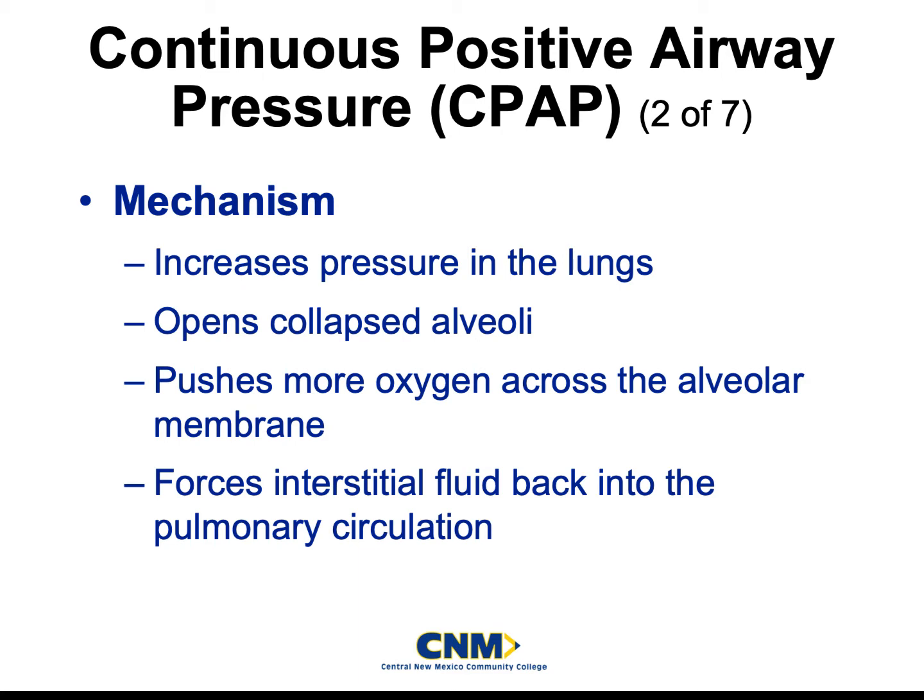This machine has something called PEEP, which is positive end expiratory pressure. We'll talk about that here in a minute. And it kind of forces the lungs open. So we are technically hyperinflating the chest of our patients, but because we are doing that through this machine, we are able to get that adequate gas exchange, which eventually is going to calm our patient down, which is going to start stimulating our chemoreceptors in our brain, and we can actually lower the respiratory rate of our patient. Technically, CPAP is a vent, guys.